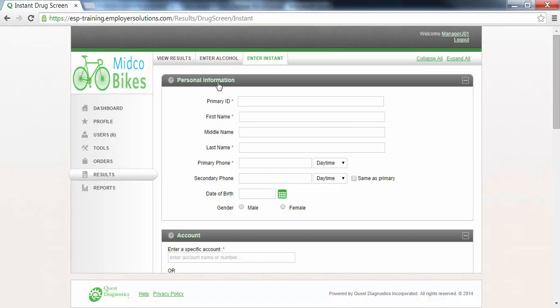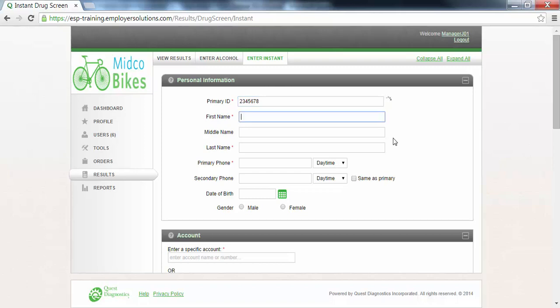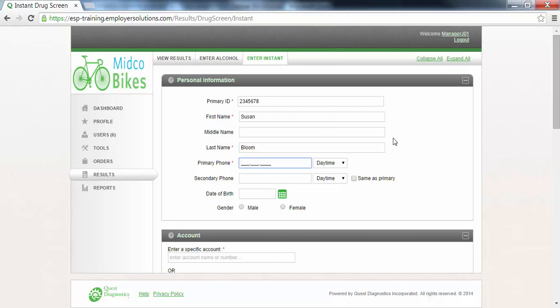The personal information section contains a list of all of the required and optional donor identifying fields. Each required field is identified by a red asterisk. The tab key can be used to move from one field to the next. Enter the primary ID. This should be a set of alphanumeric characters that are unique to the donor. In this example we will use the numbers two through eight. Enter the donor first name. In this example we will use Susan. Enter the donor last name. In this example we will use Bloom. Enter a primary phone number for the donor. You have the option of selecting whether the phone number is a daytime or an evening contact phone number.